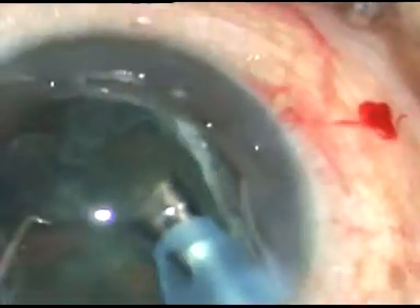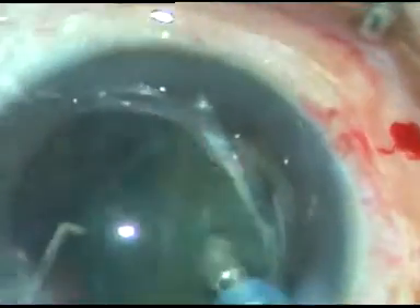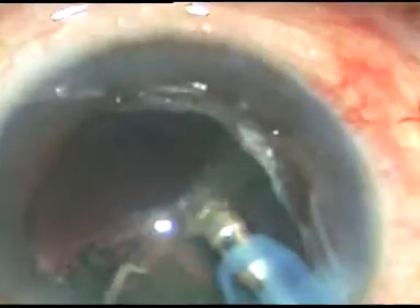This is a very simple, very safe, very fast technique — the lens tilt technique. Our guru, Dr. K.K. Mehta, described this technique as the lens salute technique.